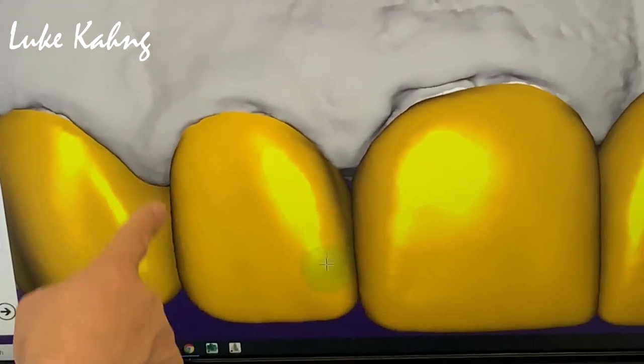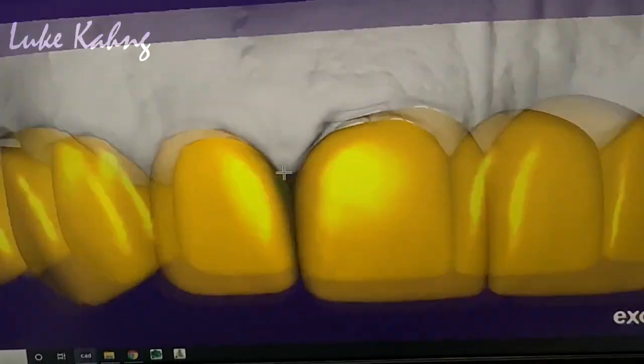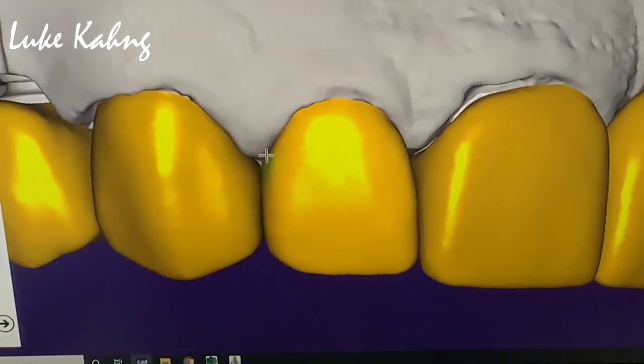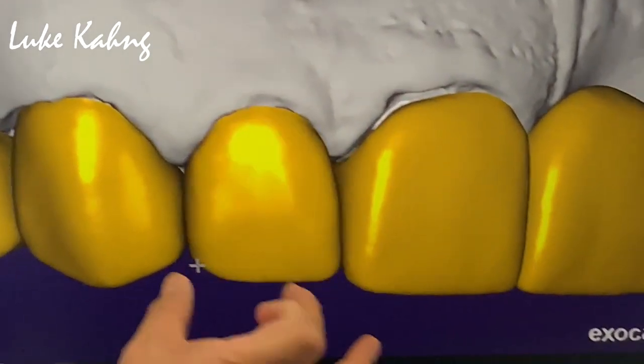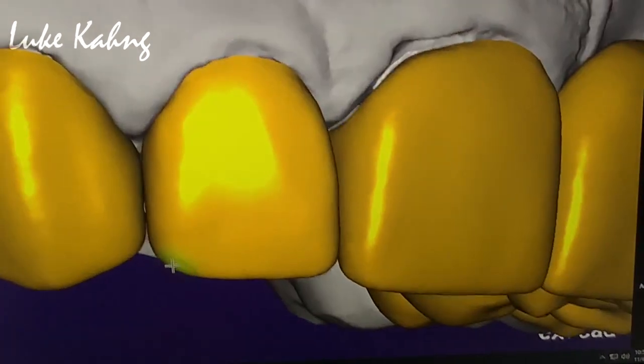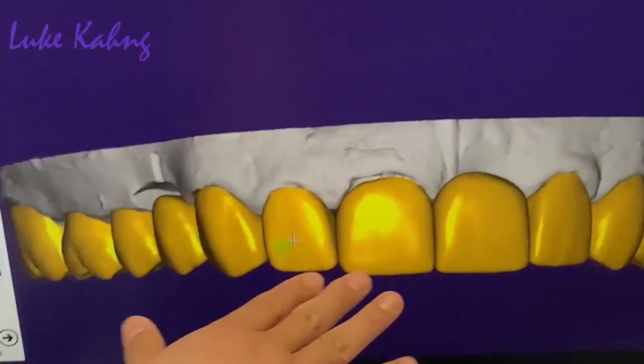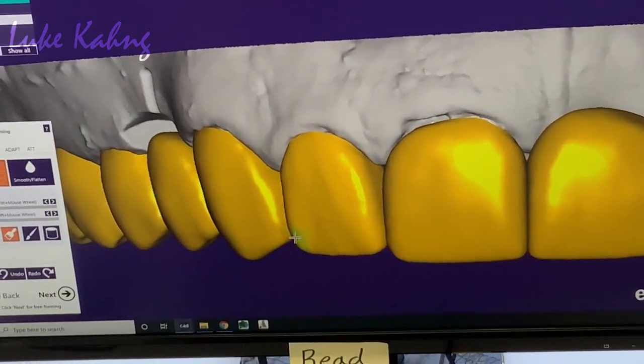Yep, especially this. Then our proportion is good. It's called golden proportion. This is two eyes. Now go to here. Finish lateral first.